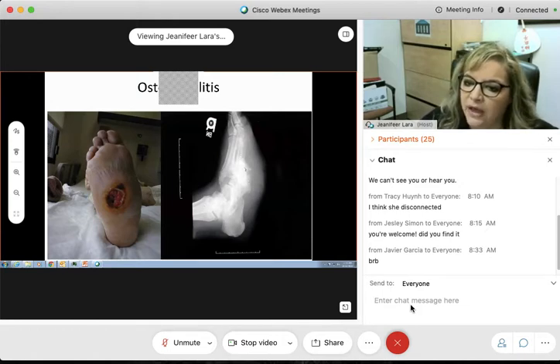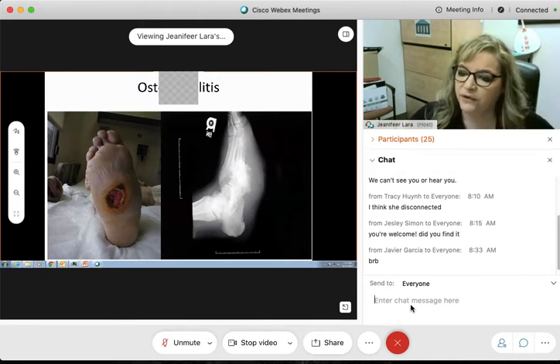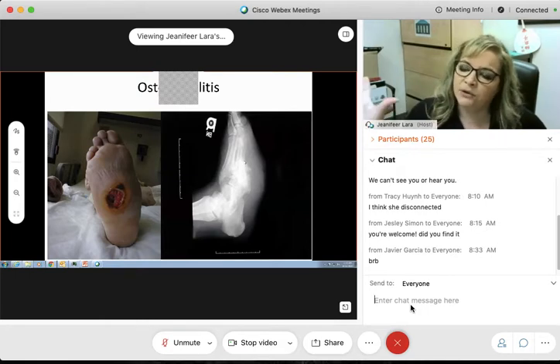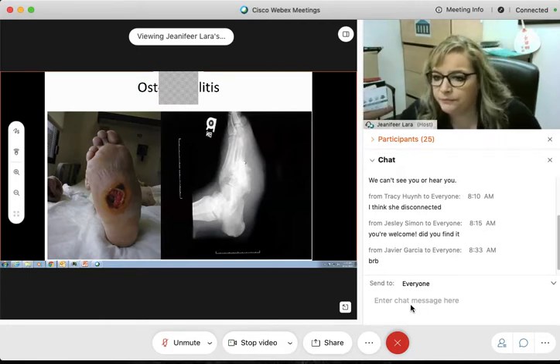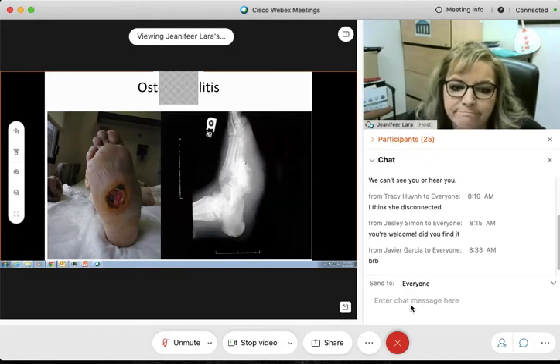So this could have, because we start to see this round kind of brightness, there are two things. You have excess of fluid, excess of tissue, or you start to have calcifications, which is osteoclast breaking down and osteoblast building up. Okay? Did that answer your question?